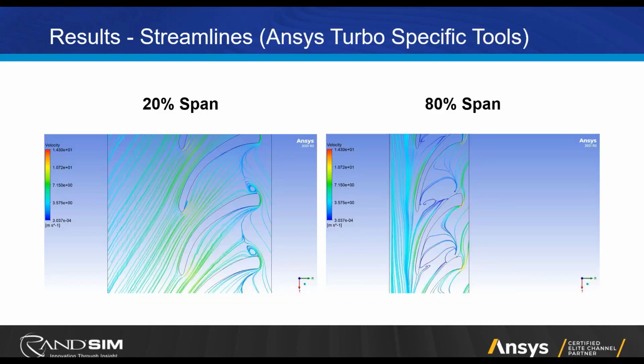Next slide, please. Okay. So here are those same streamlines, but in the turbo views that I mentioned earlier. You can see it's a lot more insightful here. You can see a lot better, even better than in the vector plots, what's happening. The flow misalignment, you can see at the leading edge. You can see flow separation and recirculation at the trailing edge. Again, these blades are not idealized at all. They're very wide, and you wouldn't ever do that because it causes a lot of wake effect downstream. So this is just for illustrative purposes. But the streamlines are a very effective tool for looking at the flow field through the blade passage in these views.